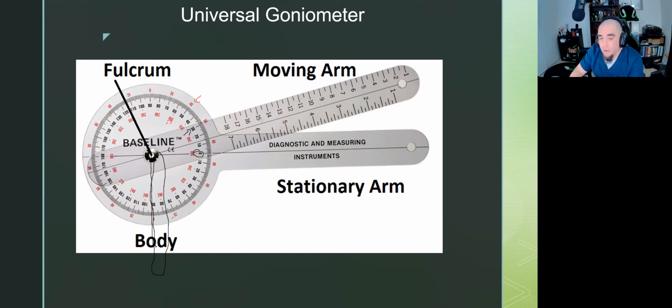So I need to measure off of my exterior angle numbers versus my interior angle numbers, because this happens a lot. So with the ankle, let's think of the way the ankle is shaped. The ankle is shaped like an L, right? So with that L, it's really hard to start a goniometer where we can get a measurement that lines up. We can do it, but it doesn't always work out that well.